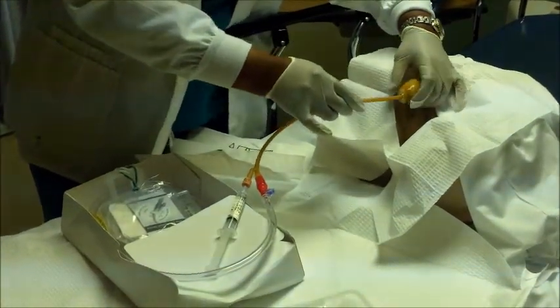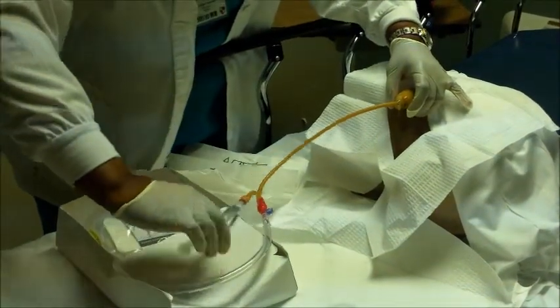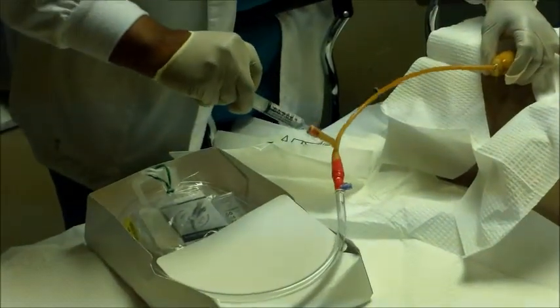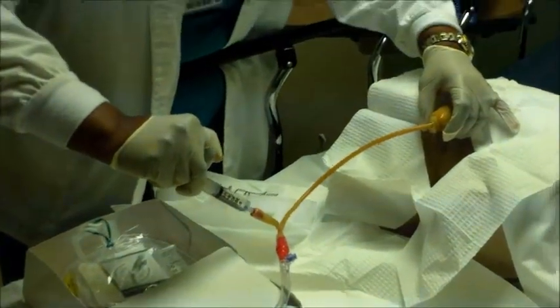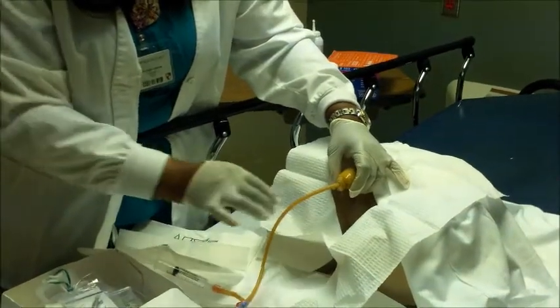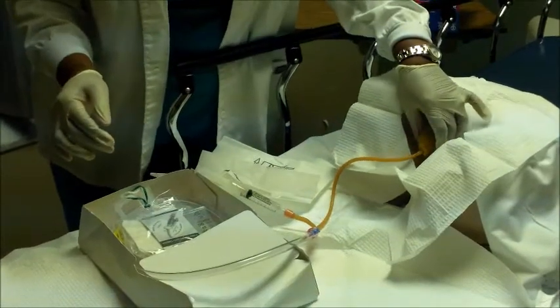Okay. Now, at this point, I will inflate it with 10 cc of normal saline. I'm going to pull back on it just to get the resistance. And that is the insertion of a Foley.